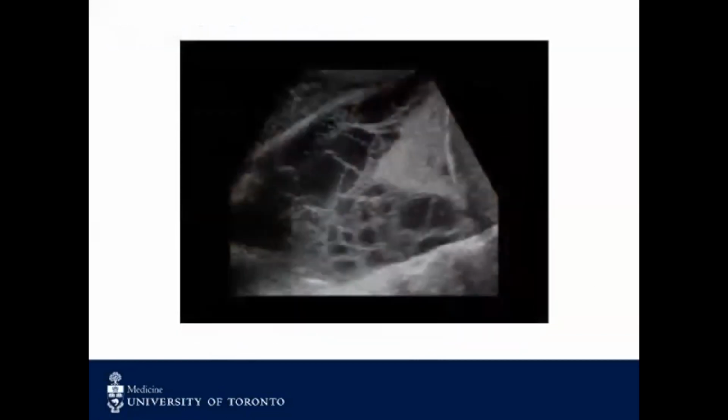The one other thing I wanted to talk about is that lung ultrasound here is great at looking at empyemas and abscesses, and even rivals CT in these domains. So when you're looking at a patient, scan multiple areas, and you may find something that helps you build your case.